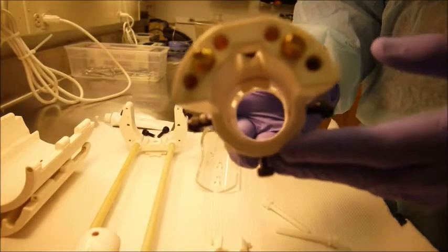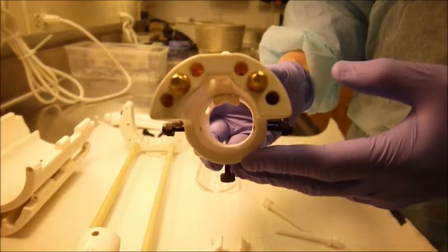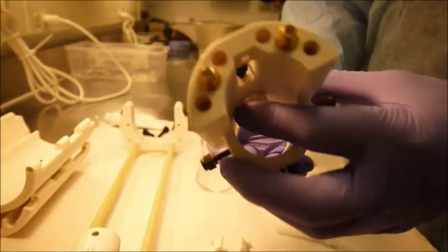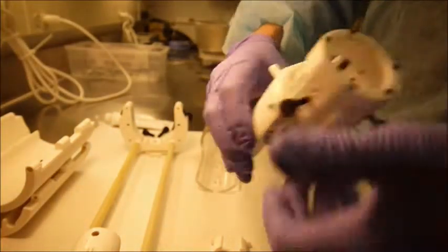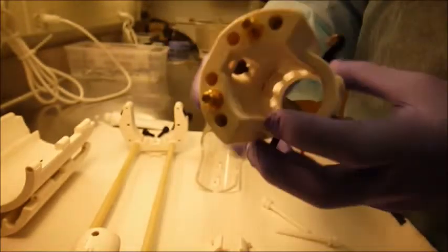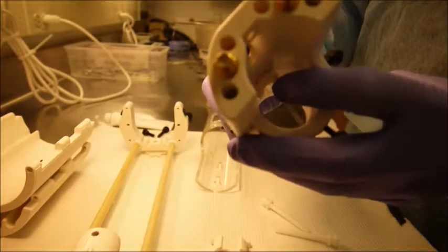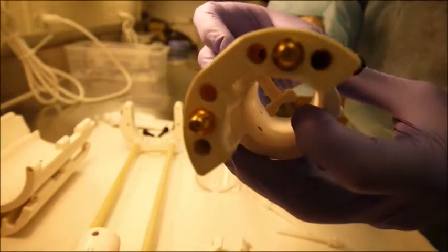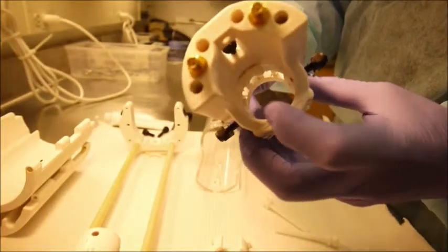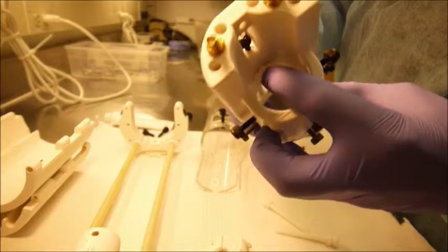This is the front end of the quad transmit receive coil showing the cable connections and color coded ports for tuning rods. Shown is the back of the coil where you insert the head strap. The piece hanging from inside the coil is the nose bar, measured perfectly to fit the bridge of the animal's nose when the head strap is locked in place.